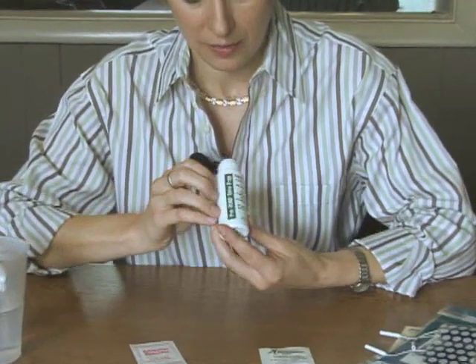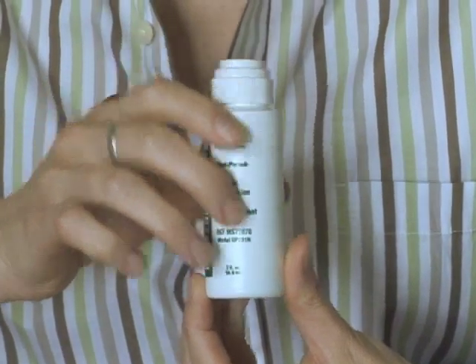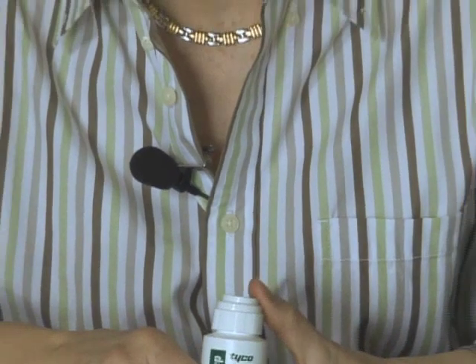Another issue is that some people do have problems with perspiration. They have heavy perspiration, and the electrodes don't stick as well. In those cases, one of these skin preparations can help with that, particularly this pre-TENS skin prep, because it also has an antiperspirant on it. If you wear the electrodes while you're outdoors in hot and humid weather, or you wear them while you work because you're using TENS while you work for pain control, and you're perspiring, this could be a great product.